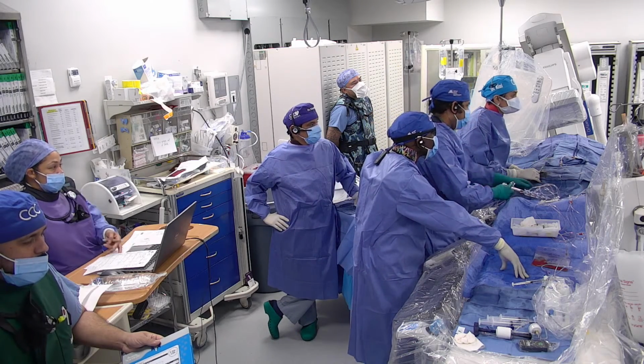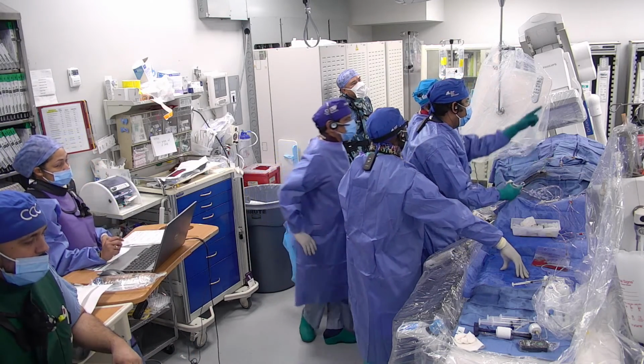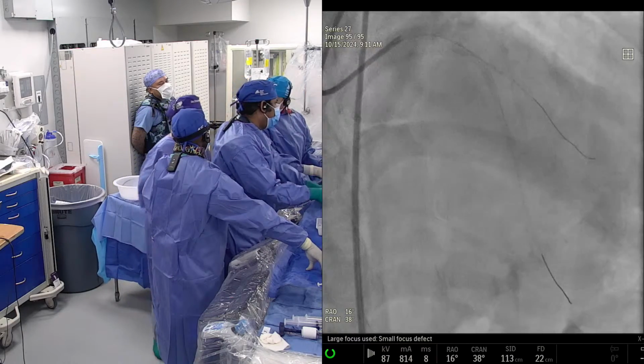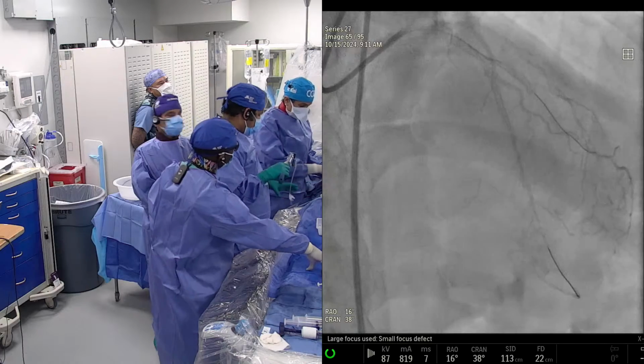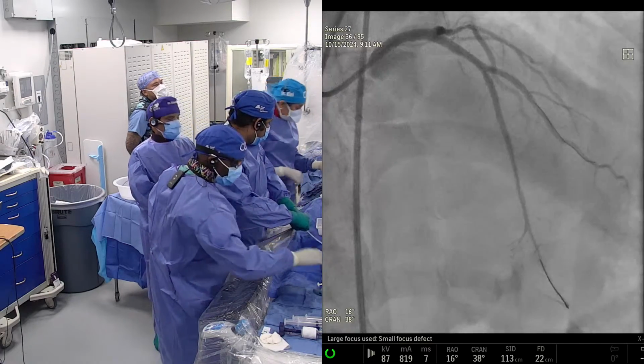One of my clear appreciations is what you mentioned about. I wanted to take up that issue. I think drug-coated balloon. Yeah. We are going to be dealing more and more with INOCA, without doubt. And I think the IVUS of the LAD.